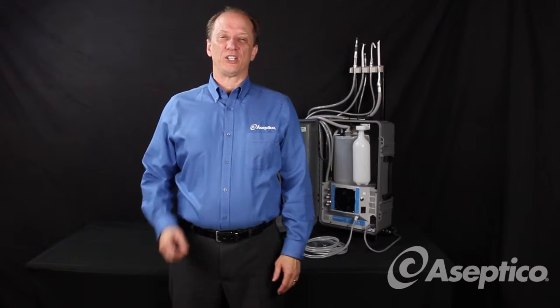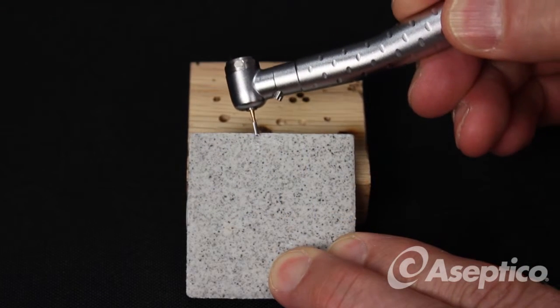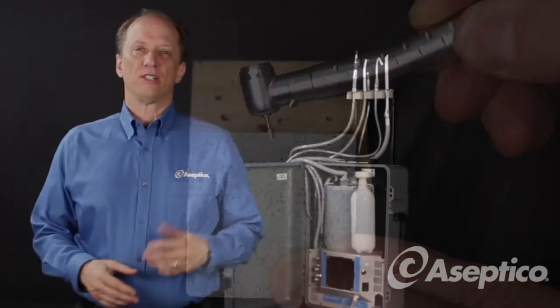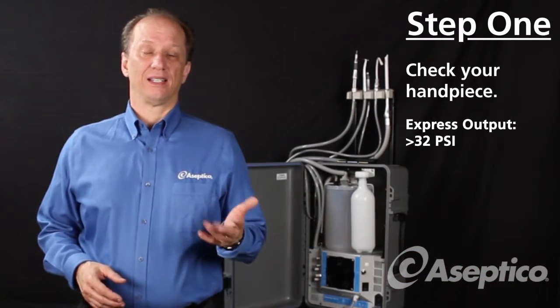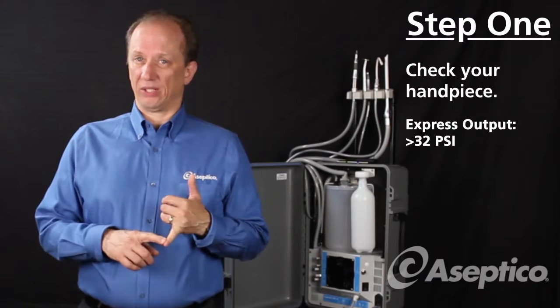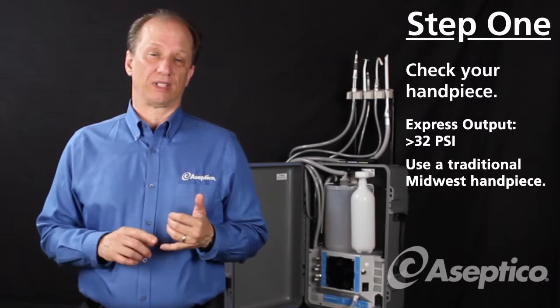The first thing you want to do is make sure that you're using the correct handpiece. The Express Portable Unit outputs 32 PSI or greater, and that's plenty of power to cut teeth. Some high-end handpieces require almost 40 PSI, and so those won't work on this unit. Midwest, the traditional Midwest handpieces, require normally about 30 PSI, and those will work perfectly on the Express.